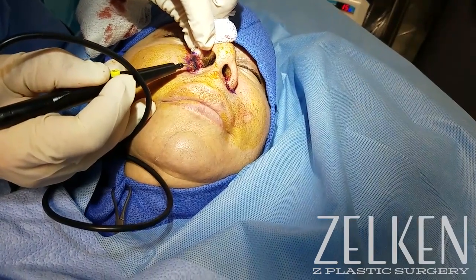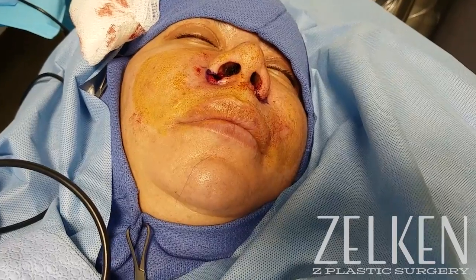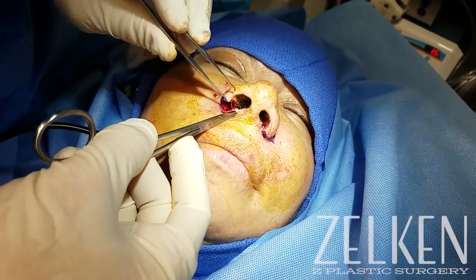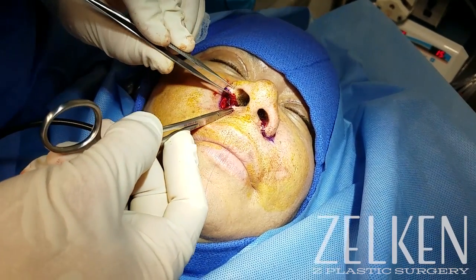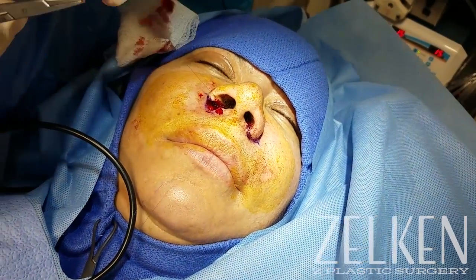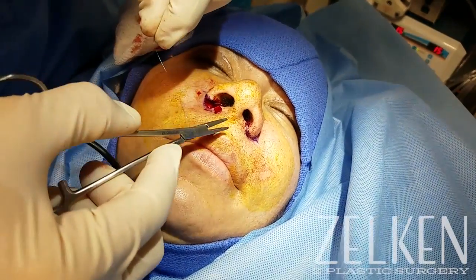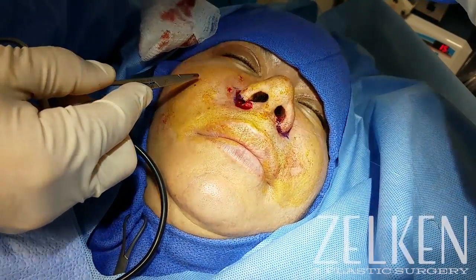Instead of using an Adson-Brown forcep, I'm going to use my finger and a Raytex sponge as much as possible to grip the lower lateral tissue, because even atraumatic forceps can cause injury to the dermal edges. I can't promise that I'm going to create an invisible scar, but I certainly can do my best to avoid maneuvers that will increase the tendency for a hyperemic or hyperpigmented scar in this Fitzpatrick IV patient with sebaceous tissue.